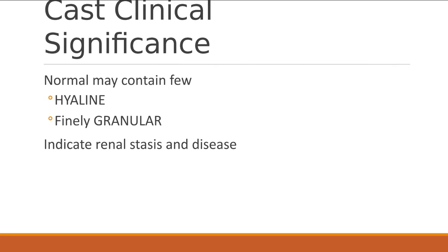Your hyaline casts are pretty colorless and pale. Most of them are colorless and pale, and because they are, it can be a little difficult sometimes to actually see them. You can also get an increase in casts if you do a lot of strenuous exercise, but if people haven't been exercising like that, within a day or two their casts are going to go away.